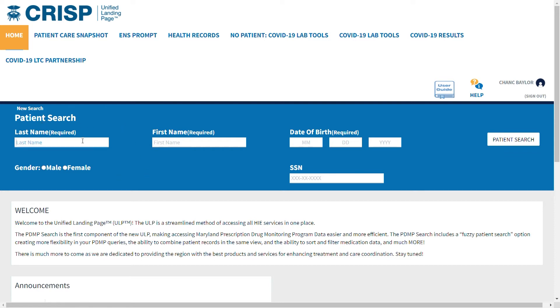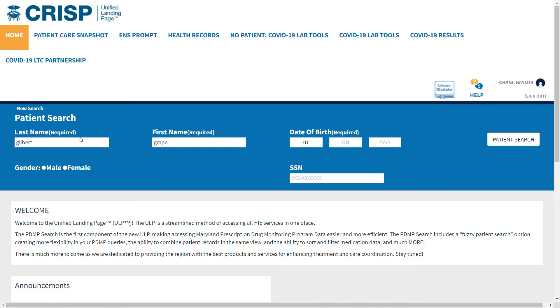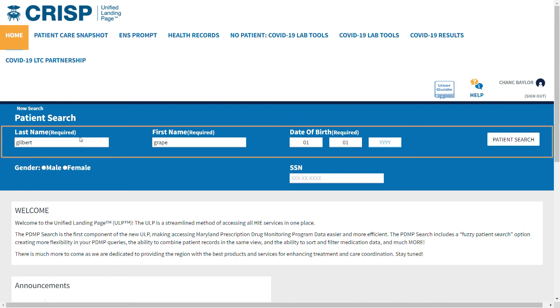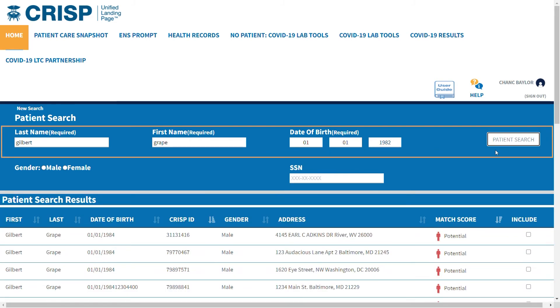Once you've logged in, search the patient whose results you are submitting. Remember, a successful patient search requires the patient's first name, last name, and date of birth. Enter this information, then click the Patient Search button on the right.